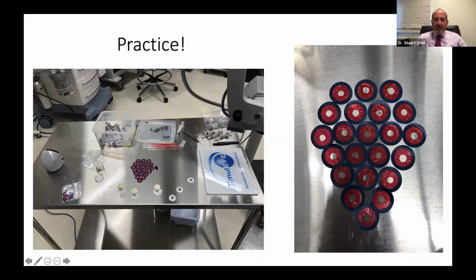They're continuous, they're curvilinear, they're well centered, and I was using 3 different models here to keep things set up and moving along. It doesn't require a lot of setup or a lot of time. You spend an hour or 2 doing this, and you're going to gain a lot of ground. And do that a few times over the course of a month, and it's going to be amazing.